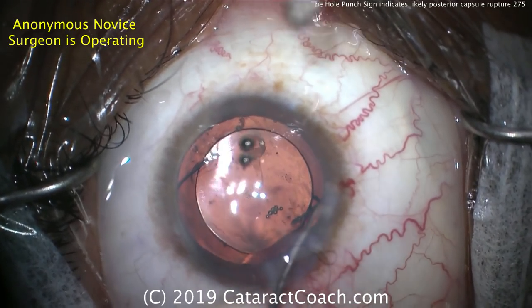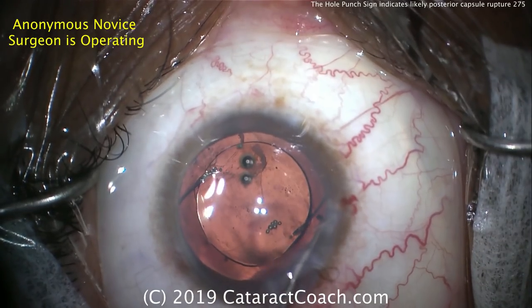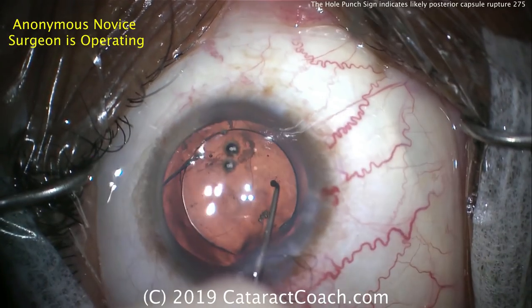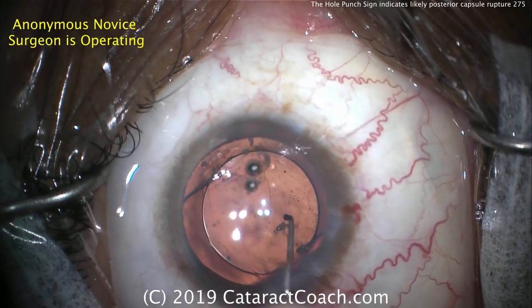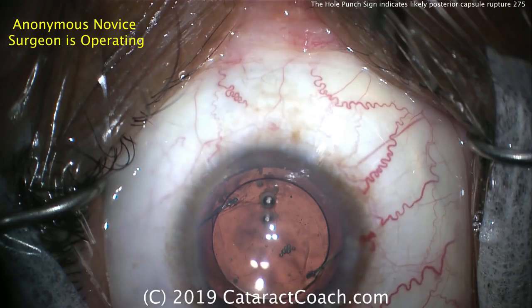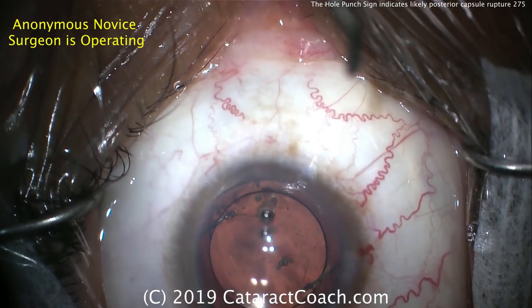Repositioning it just a little bit, getting it into ideal placement — we look great here. In a case like this, do you need to do a peripheral iridotomy? No, you don't. With a posterior chamber lens, if it's in the sulcus completely, you don't need to. Certainly if you have optic capture like this, you don't need to either.